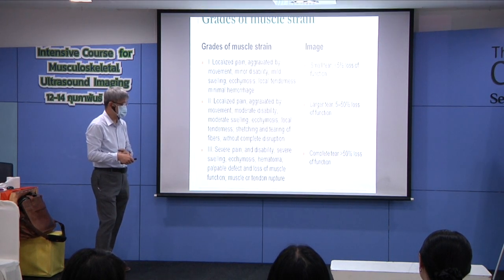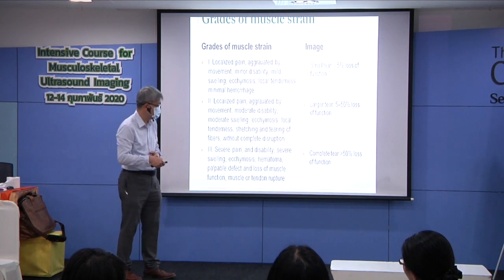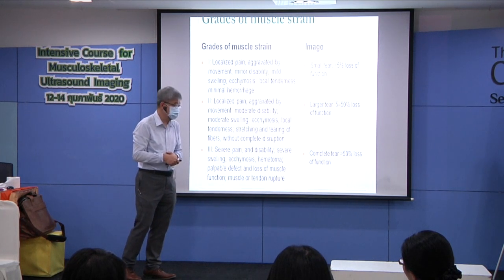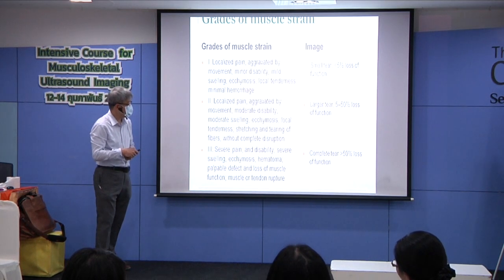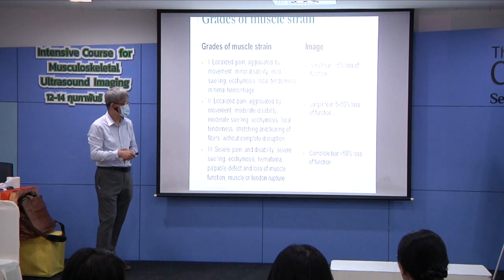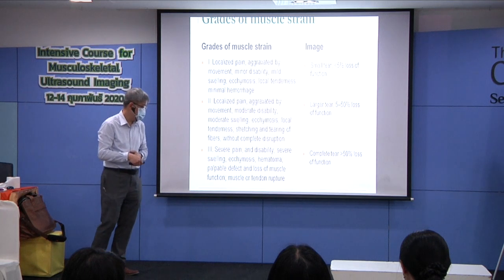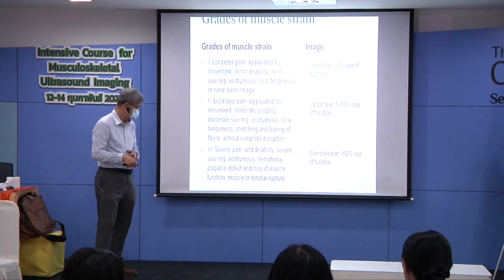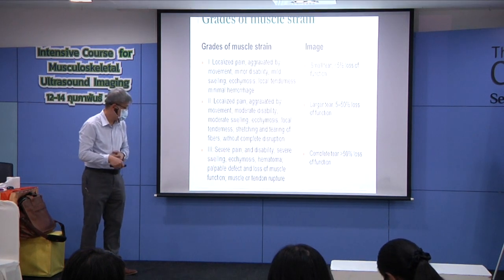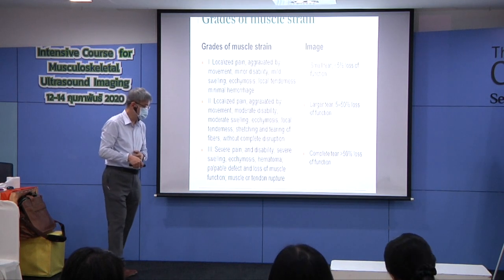This is a larger tear, and this kind of finding may lead to 5% to 50% of functional loss. So you can use the tear size in the cross-sectional area to predict the loss of function. If they are massive or a very big area, showing hypoechoic hematoma or swelling, you can predict it's a complete tear, and the loss of function will be over 50%.